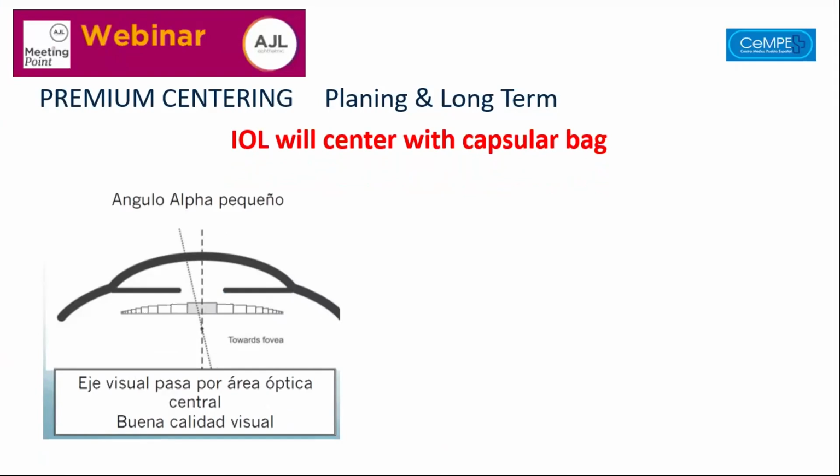So we are going to plan to put a CTR, and now we know the IOL is going to get centered with the capsular bag. So if the alpha angle is small, sorry for this, it's in Spanish, but I didn't have this picture in English, you ensure that the distance between the visual axis and where the lens is going to get centered is not so big.